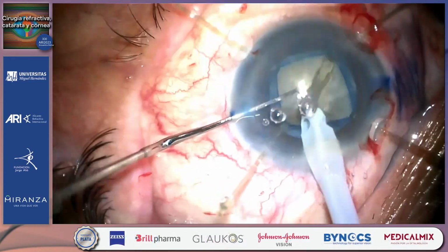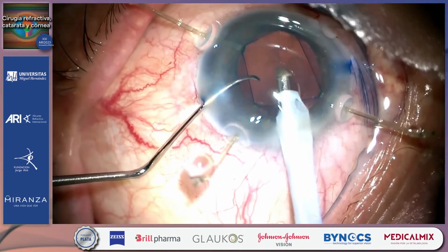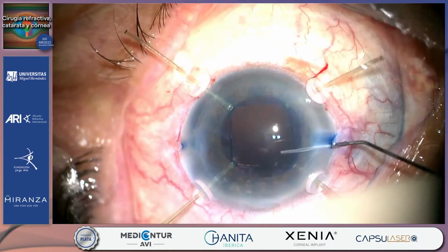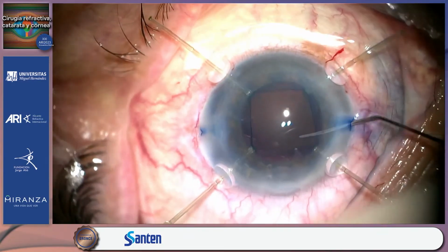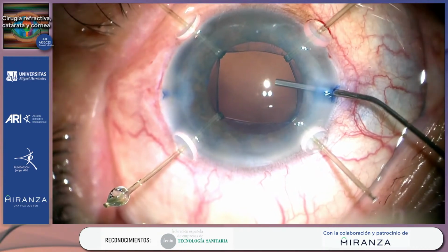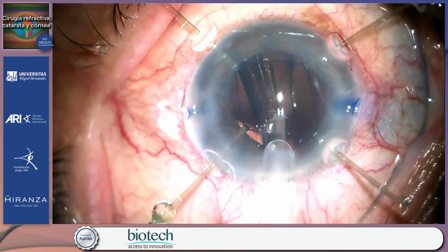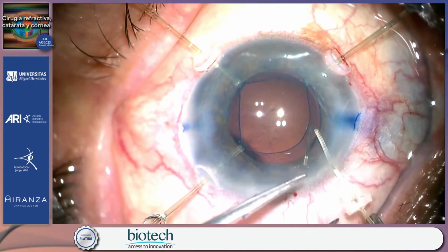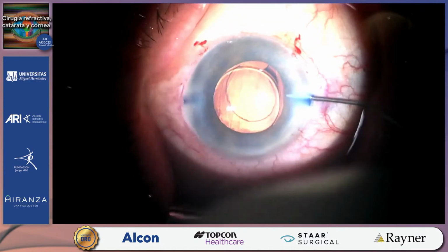Uncomplicated phacoemulsification was performed. After hydropolishing the posterior capsule, OVD was again injected and a single-piece IOL was implanted into the capsular bag. However, after removal of the capsule support system, I was not happy with the stability of the capsular bag. So OVD was again injected and the capsule tension ring was implanted.